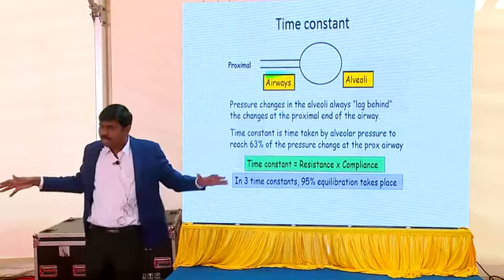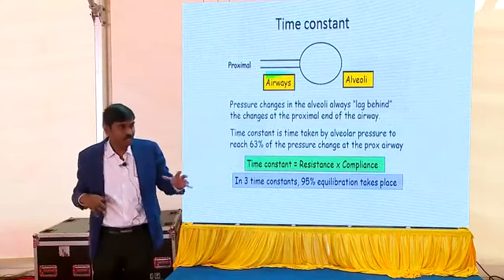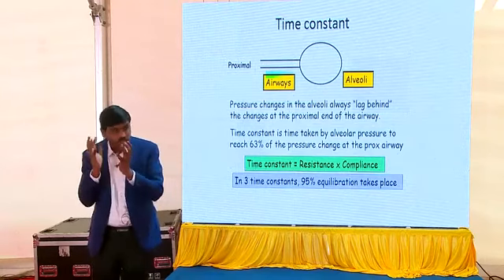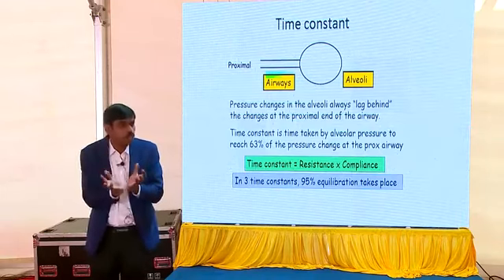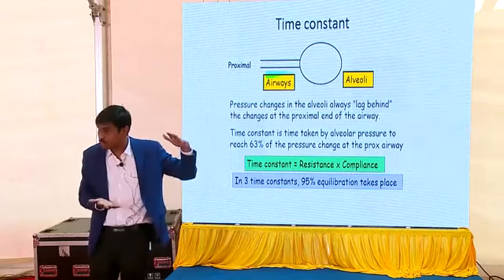Hope I'm not confusing. Even I thought the same when I started: you can build up a lot of air inside, but even when it's very stiff, with little air coming in, the pressures are going to rise. It's like there's no more space to expand, so quite soon your pressure will build up.